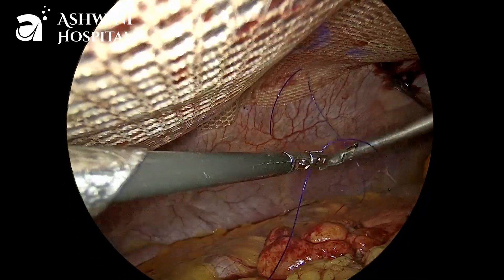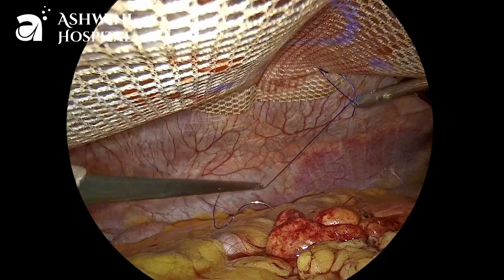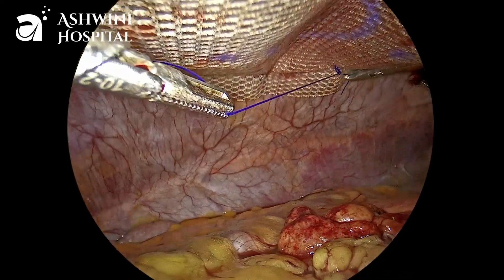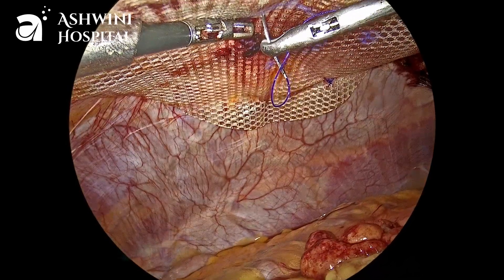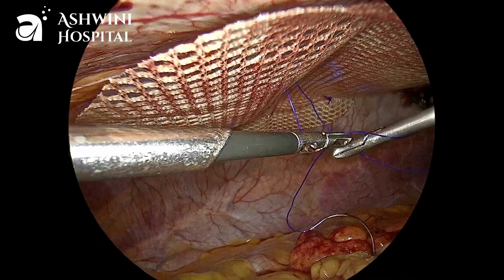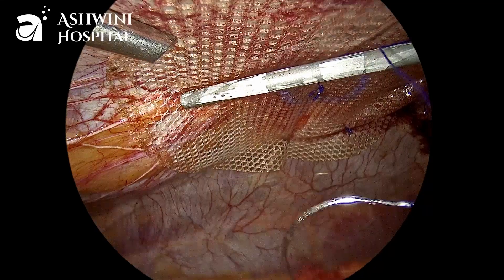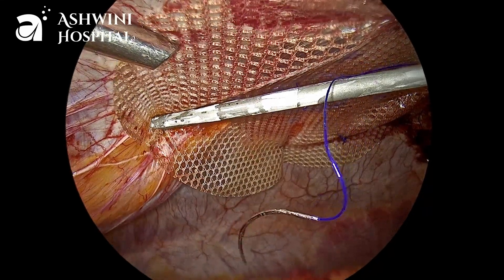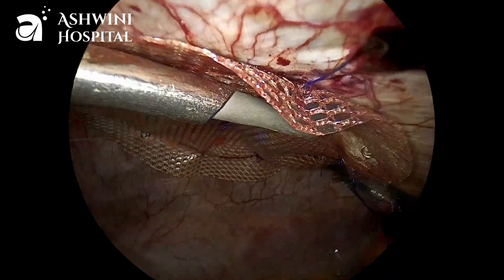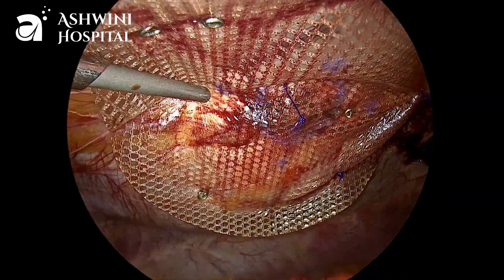We can fix the mesh using either tackers or intra-corporeal sutures — in this case we are showing both methods. This is the suturing method, using 2-0 prolene. Suturing takes a little more time but saves cost by avoiding tackers and is also secure. Now this is the tackers method — we can use absorbable or non-absorbable tackers. Tackers are faster than suturing. We can do either way, whichever is comfortable to the surgeon.